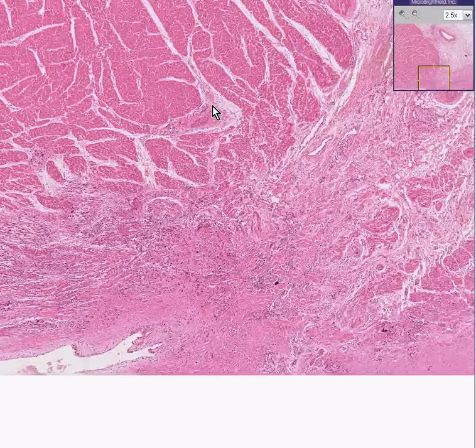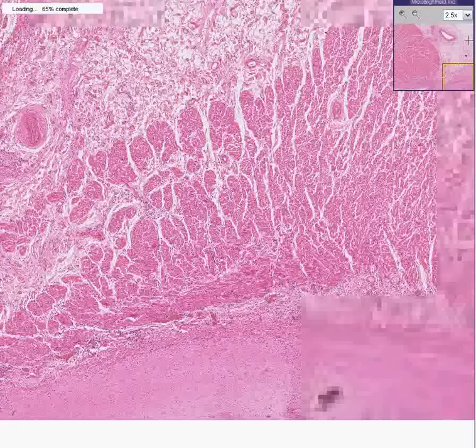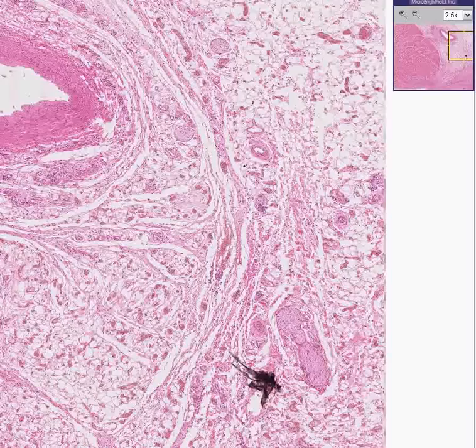Not only is rheumatic disease frequently found as a myocarditis and a pericarditis, as we see here in the subepicardial fat, but as you know, in the old days and perhaps even now, it is the single biggest cause of endocarditis as well. Rheumatic fever is one of the biggest destructors of heart valves.